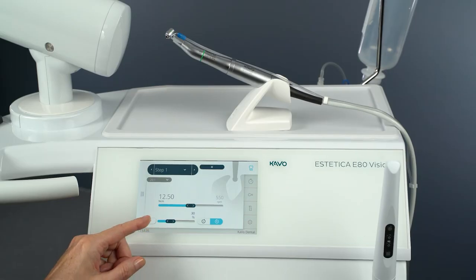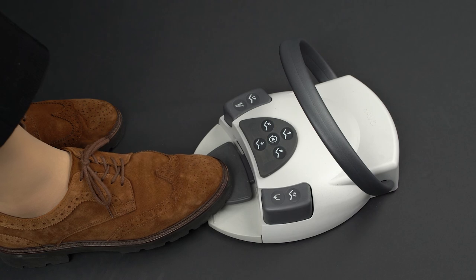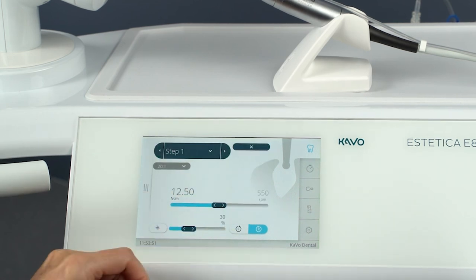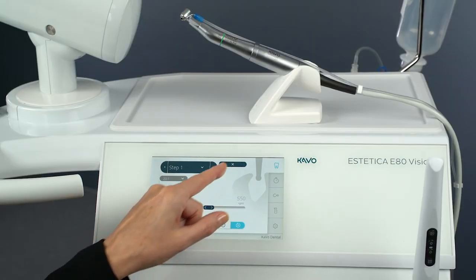Tap the Auto Calibration button and follow the instructions on the display. Press and hold the foot control until the message 'Calibration Successful' appears on the display. To end the calibration, tap the Cancel button. To exit surgery mode, tap the Cancel button.